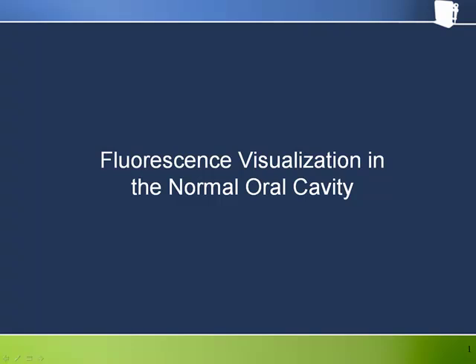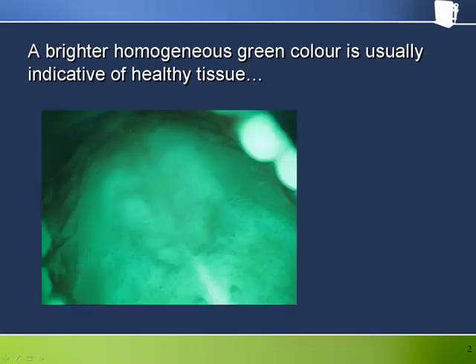Let's take a tour of the oral cavity and see up close some pretty typical examples of normal anatomy and its variation using fluorescence visualization with Velscope. A brighter homogeneous green color is usually indicative of healthy tissue. This is due to the combination of predominantly green fluorescence from both the epithelial and stromal layers.